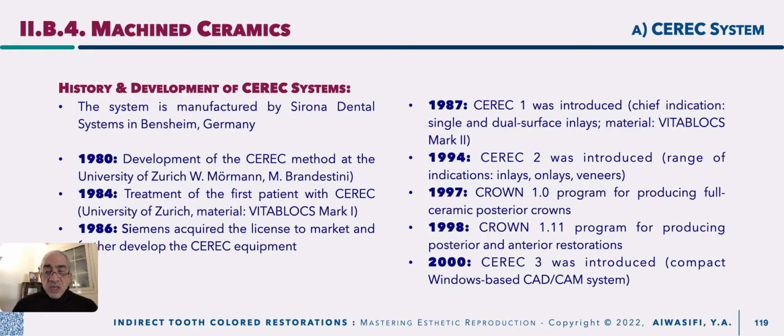When reviewing the history and development of CEREC systems, the idea was developed at the University of Zurich, as we mentioned, by Dr. Mörmann in 1980. But it came to life, it was born, in 1984, when they treated the first patient with a CEREC restoration using Vita Blocks Mark I. Then in 86, Siemens acquired a license to market their CEREC equipment.